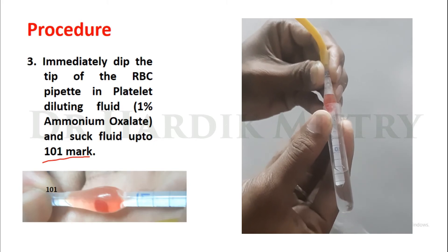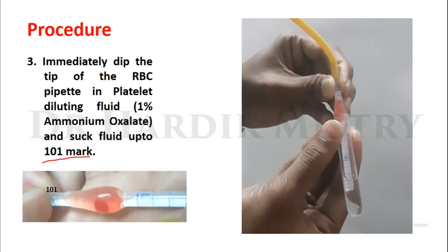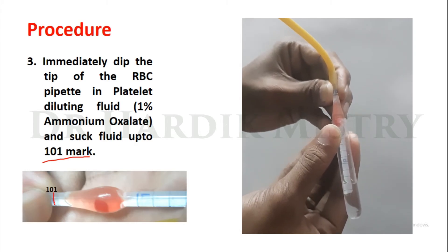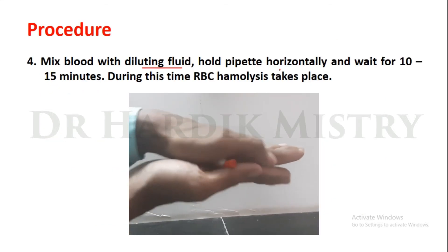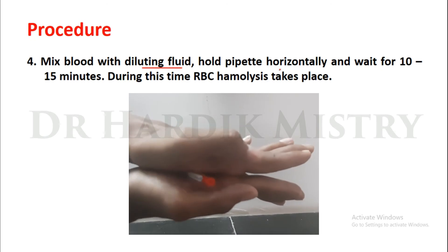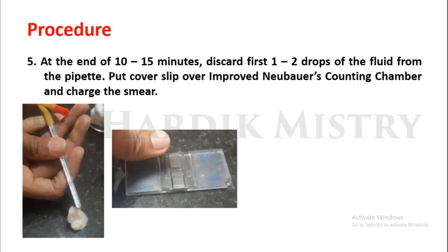Once you have collected blood up to the 0.5 marking, immediately dip the tip of the RBC pipette into the diluting fluid and suck fluid up to the 101 mark. Mix blood with diluting fluid, hold the pipette horizontally, and wait for 10 to 15 minutes — during this time RBC hemolysis takes place. At the end of 10 to 15 minutes, discard the first 1 to 2 drops of fluid from the pipette.